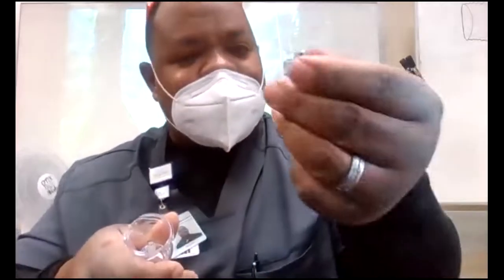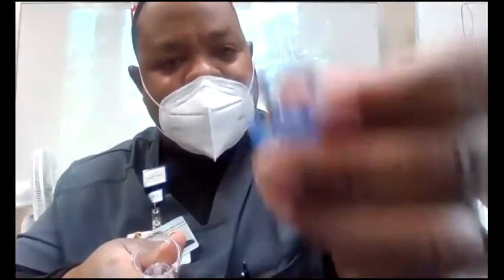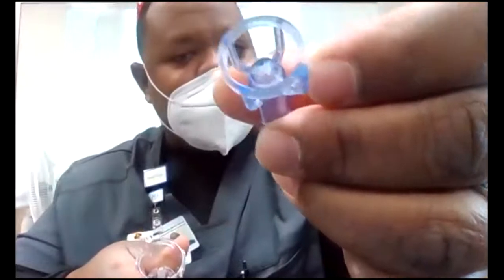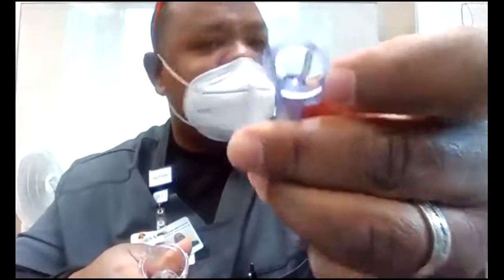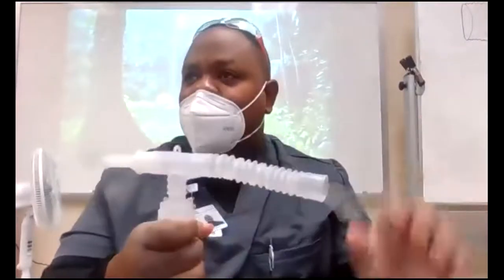Because air is coming. See that? There's a little spigot right there that air is coming out of. And what happens is it is pushed through this baffle. And when it comes across the top of the baffle is when it generates those particles. Really amazing how they do it. But as soon as I put this on here, see that? A whole lot, right? Then I have to put this on there and this will kind of guide it the right way.